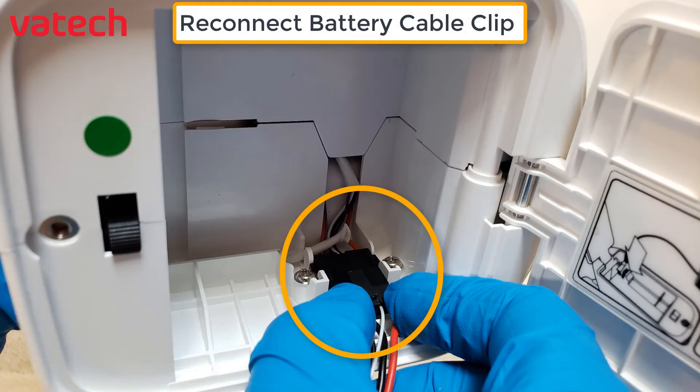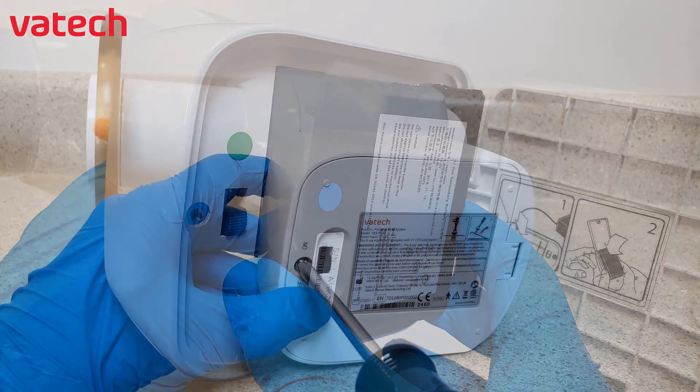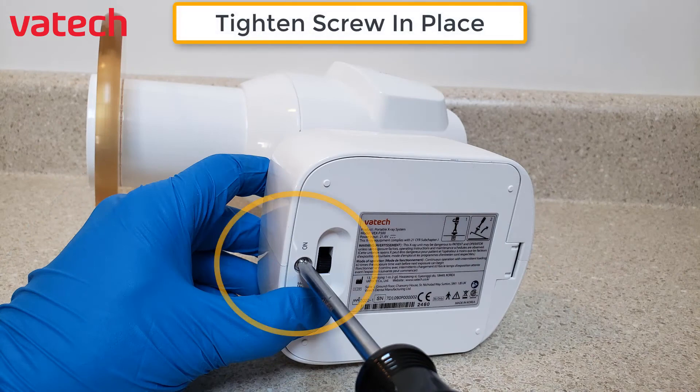Go in reverse and reconnect the battery cable clip again. Tilt and slide the battery back in place. Use a Phillips screwdriver to tighten the screw in place as well.